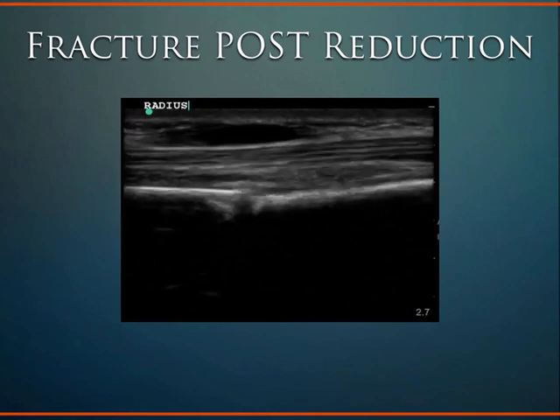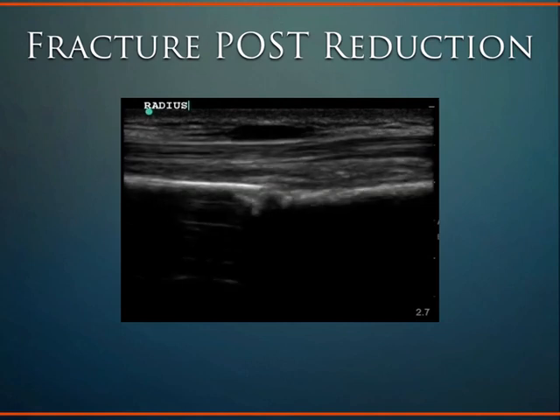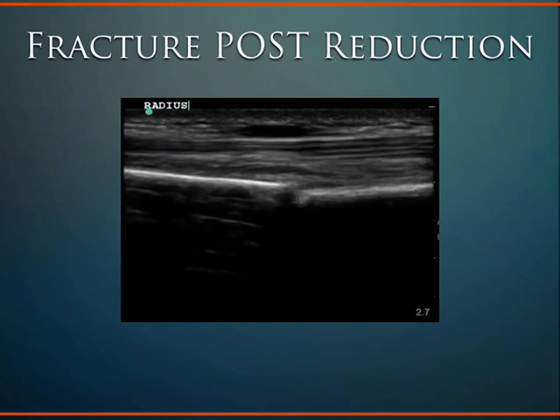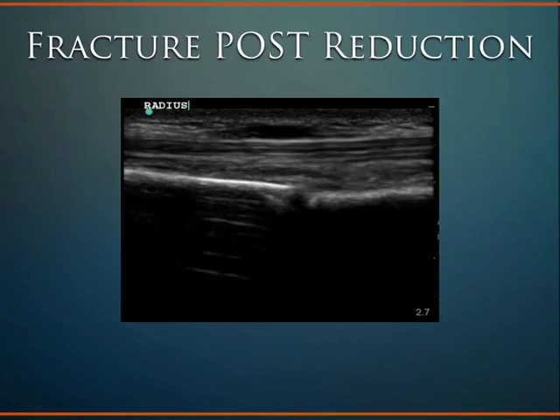And if you've ever done this clinically just by traditional methods, it can be quite cumbersome because you get the x-ray, you show the fracture, then you have to have the x-ray up, you're looking at the x-ray, you're trying to visualize the fracture, and you're moving it in what direction you feel is appropriate and by protocol.